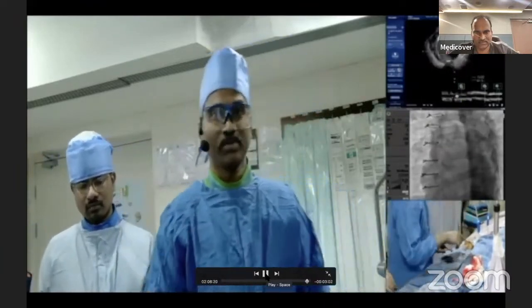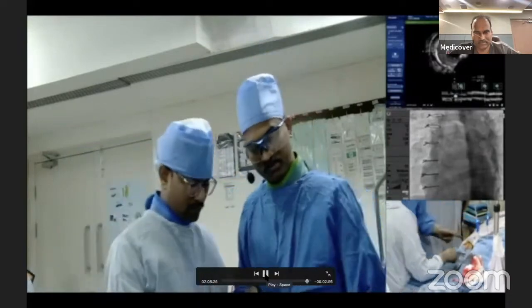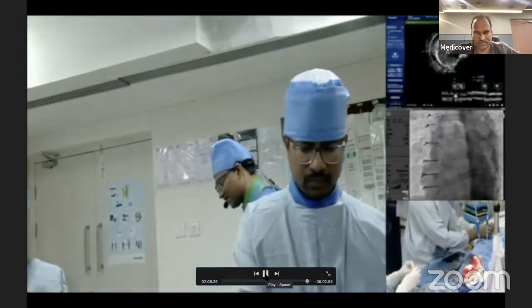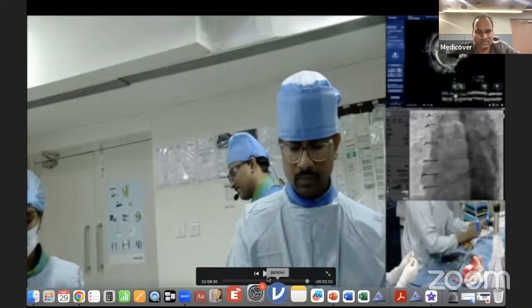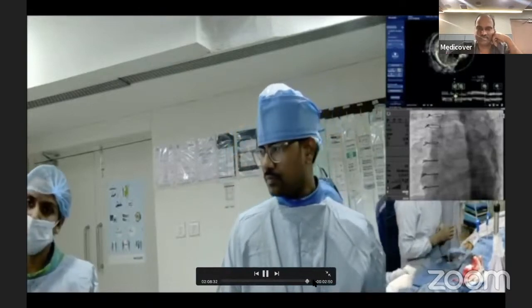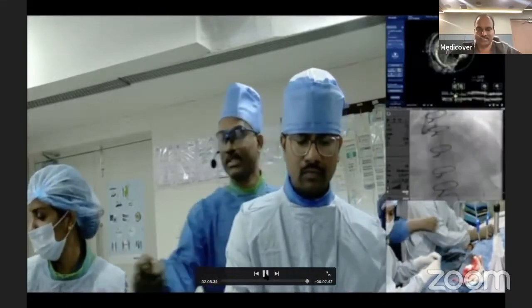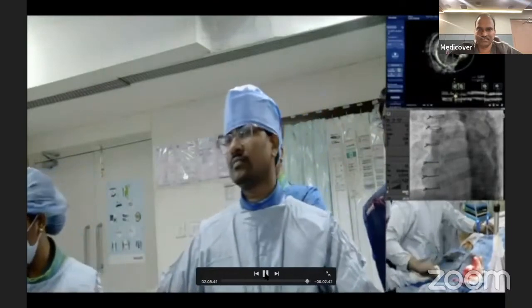So see, what is most important is time. But you want to do some here? Fine, because it's important for the audience also, since we are here. See, it is almost 5,000 milligray. Now you are protected with lead and everything. The patient is not. The patient is lying on the table, and generally you are working in just maximum one view. So he may have one area of his back or buttocks or shoulder which is getting a lot of radiation. So sometimes these patients, in future, may have a problem. So our responsibility for radiation is not just to ourselves, but to the patient also who is on the table. So the left is completely open now. So you'll have good collateralization to the right only.